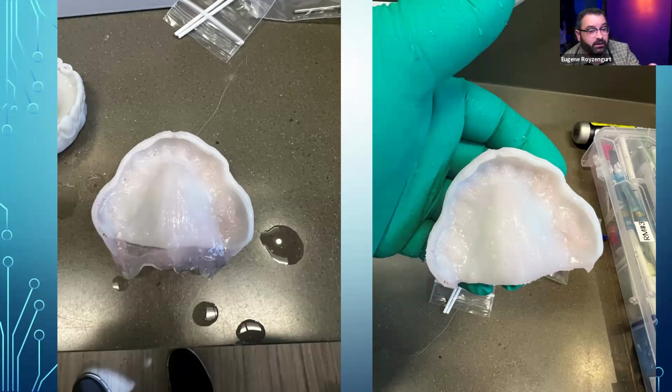As you can see here, it bonded really well. I was even able to get some extensions with this material. And I basically adjusted everything, gave it to him, said, you know what, let's let you heal up for a couple of months. Let's deal with your transplant stuff.